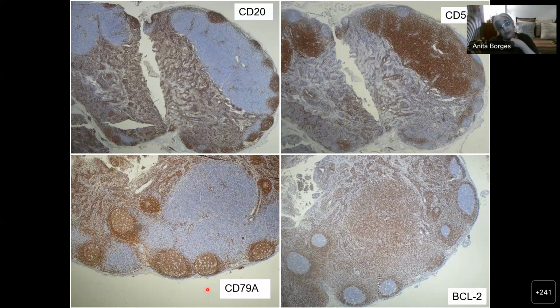And you might even feel that this is not a CD20 expressing, or it's not a B cell lymphoma at all, because you cannot demonstrate CD20. In such an instance, CD79A or CD19 will mark what CD20 is failing to mark. Also, you can use something like PAX5, which is a transcription factor, to show that those cells are actually B cells, but they have lost expression of CD20. Okay, so this is 79A, and once again, you see this beaded kind of appearance.